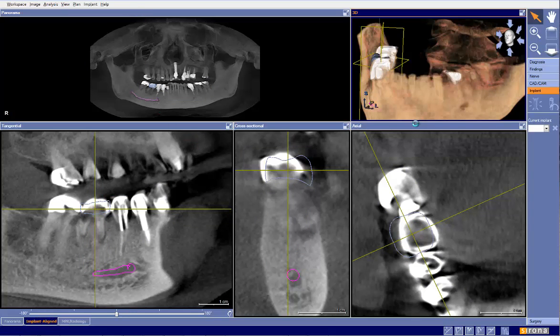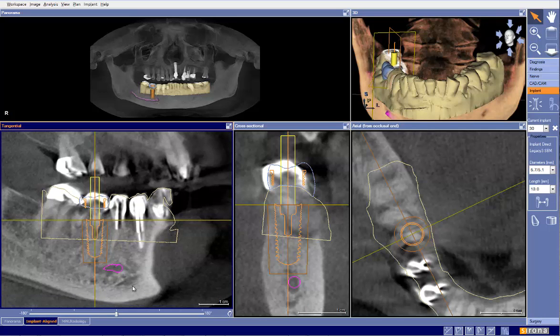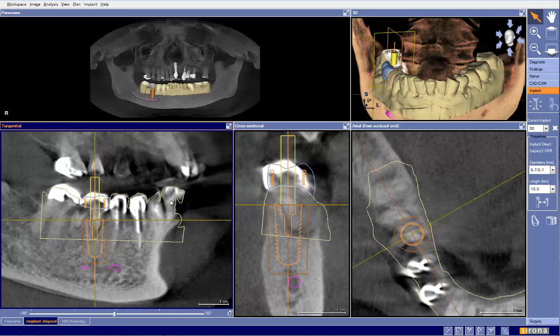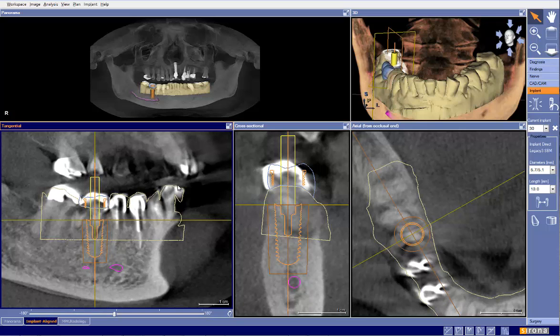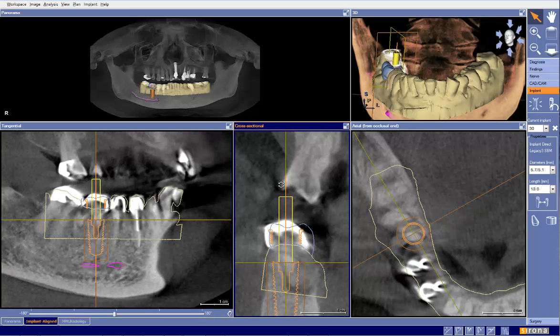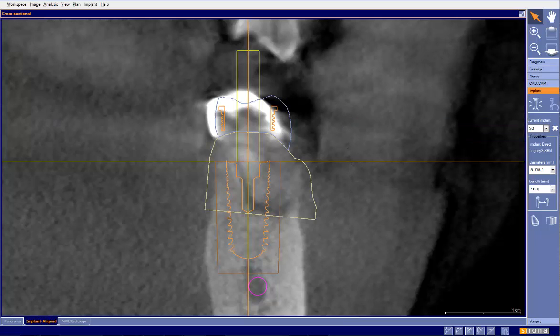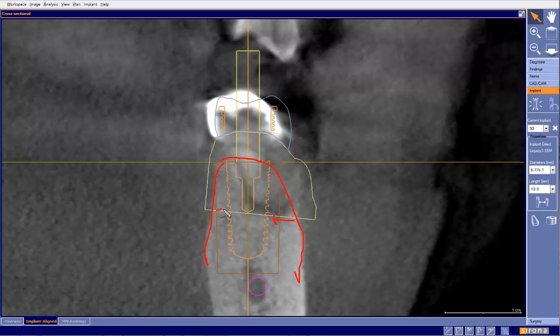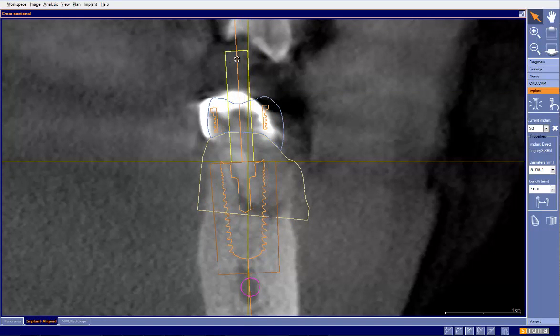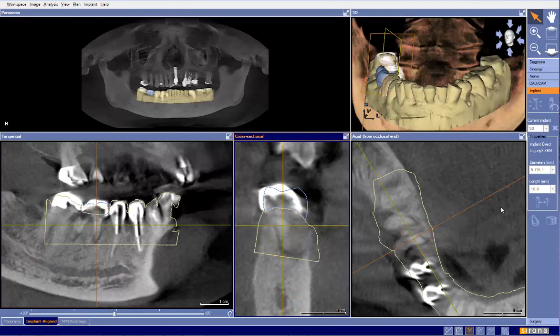Here is the new corrected plan. This one is a little bit better in terms of the occlusal plane — it's much more flat, maybe needing just a slight correction, but hardly any. I still question the location of the implant. Looking at how much space we have in the bone, our bone allows x amount of space on one side but very little on the other. I don't like leaving that plate so thin, so I would have moved this implant slightly buccal and then tilted it back to the lingual to get a little more bone thickness on the lingual side.